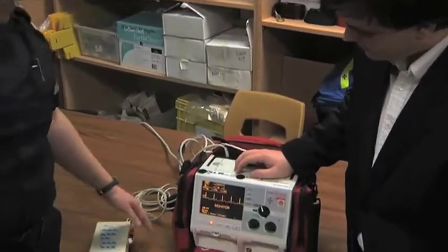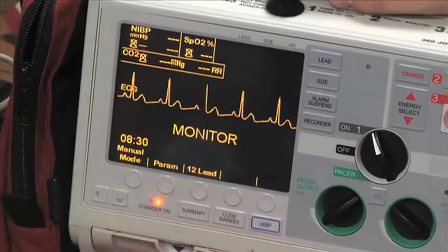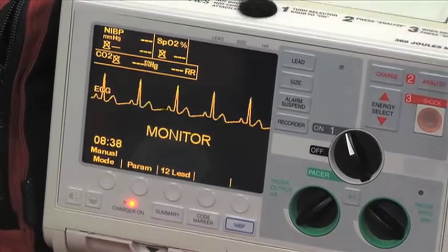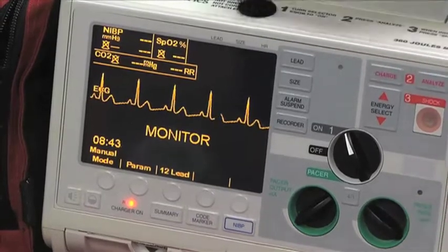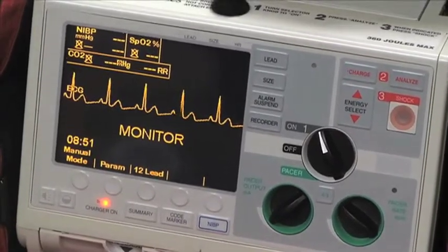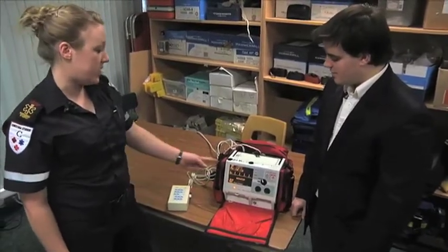Okay. And this also acts as a defibrillator. So if you were to press the analyze button, it would tell you whether or not you need to shock the heart, and that gets it back to its normal heart rhythm again. Excellent. This is the main thing that you see in movies and film when you're in a hospital. So there's truth to the movies? Slightly. Is this present in all situations? Yes, it's always a good idea to hook up the patient to the monitor, and oftentimes they can be pulseless but still have electrical activity, and that's what that line shows.